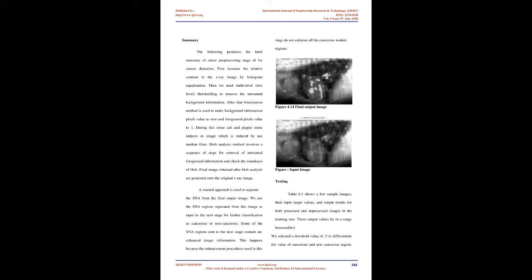It has the following 3 unique features. 1. The index of accuracy in ROC analysis is independent of the criterion adopted in the system for making a particular decision. 2. It supplies estimates of the probabilities of decision outcomes of various kinds for any criterion used by the system. 3. The ROC analysis supplies an index of the decision criterion, which reflects together the subjective probabilities and utilities that usually determine this criterion. Researchers have used ROC analysis to compare the diagnostic performance of radiologists with and without the use of CAD.